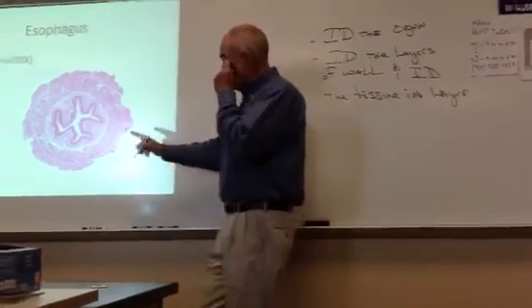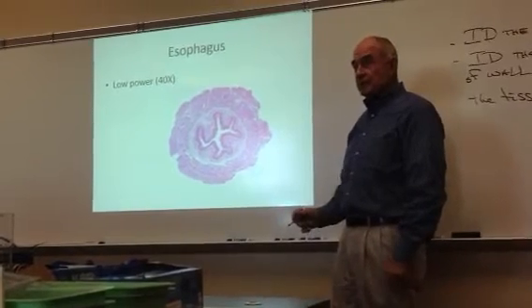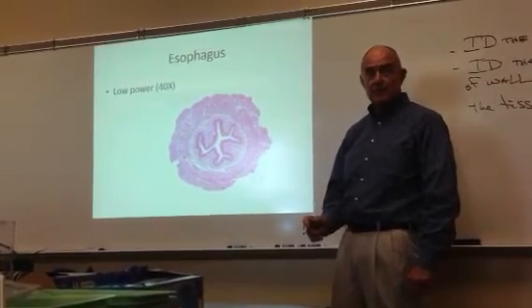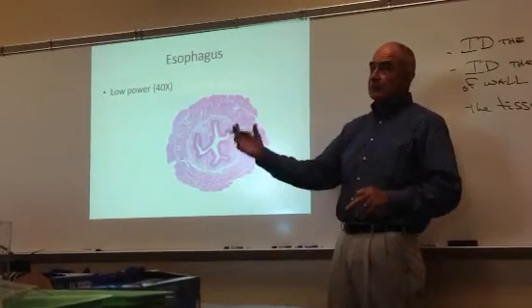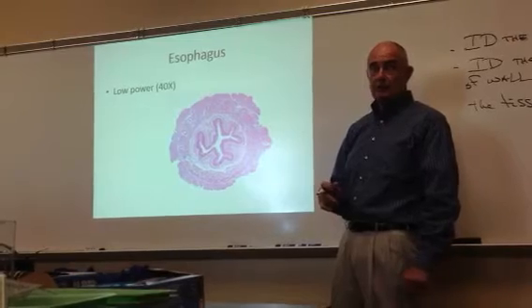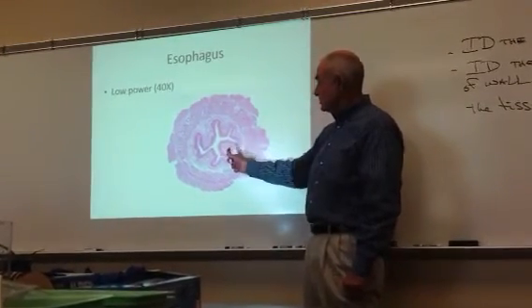So in this case, the mucosa of the esophagus is stratified squamous. Remember? Stratified squamous. It's got to be tough because everything you swallow is going to slide right down through the walls there, and you want something tough. So stratified squamous. Then it gives way to the submucosa.